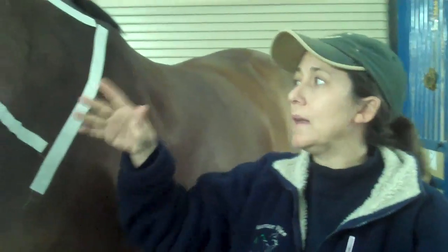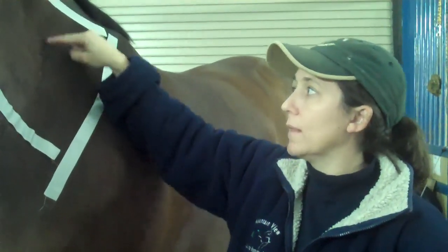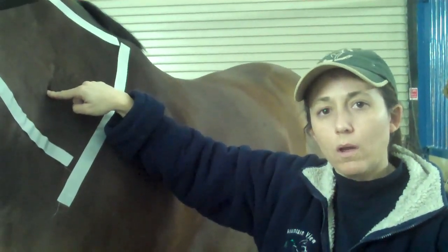If you're using a large amount like 30 to 40 mils, you're going to want to give that at multiple sites — you might need to switch sides, or give one a little bit higher and one a little bit lower. Those are the areas I like to give on the neck.